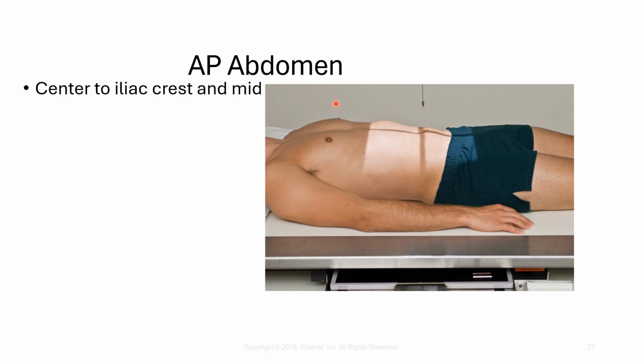They do make note underneath the respiration, which is done on expiration, that a tall hyposthenic patient may require 2 images placed portrait, but that would be an awfully tall person. But the other note references that a hypersthenic patient may require 2 IRs placed landscape, 1 centered low to include the pubic symphysis, and the second for the upper abdomen, and there has to be a minimum of 1 to 2 inches of overlap.